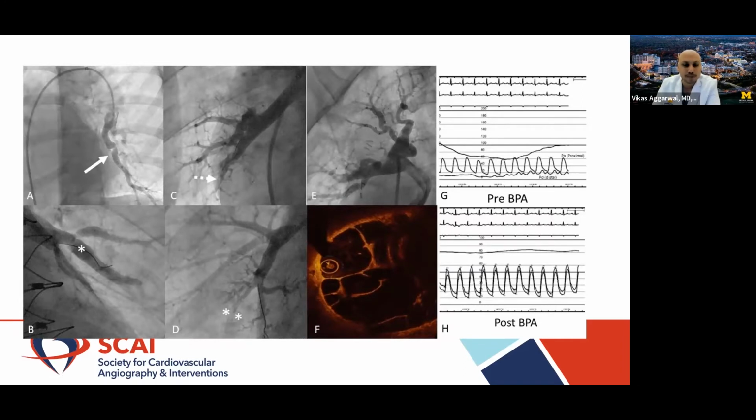For intravascular imaging in the pulmonary angioplasty space, it's pretty early on right now, and we don't see a great role at this time, although when in doubt, you could use it for balloon sizing. Pressure gradient measurement is probably more useful. It helps identify significant lesions, especially in the case of webs that are otherwise not super obvious.